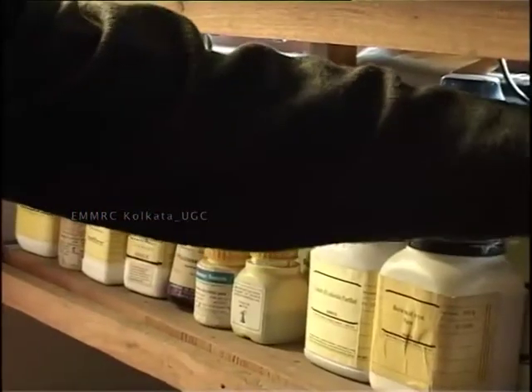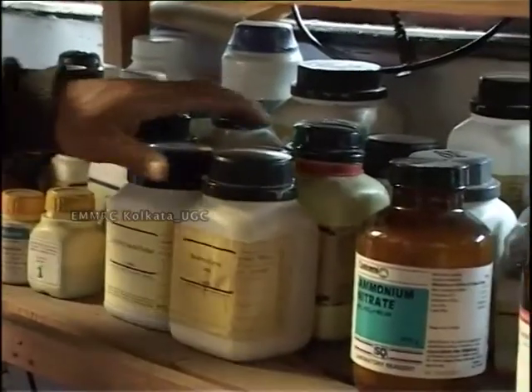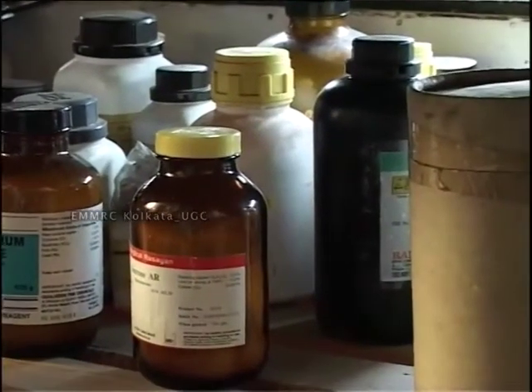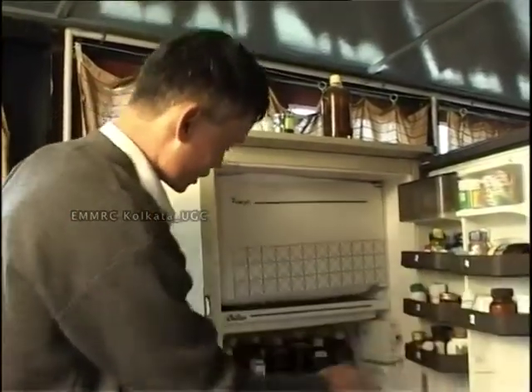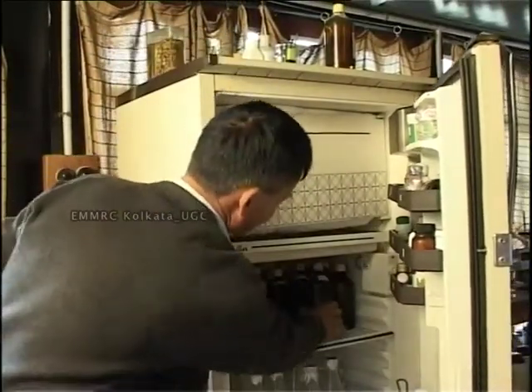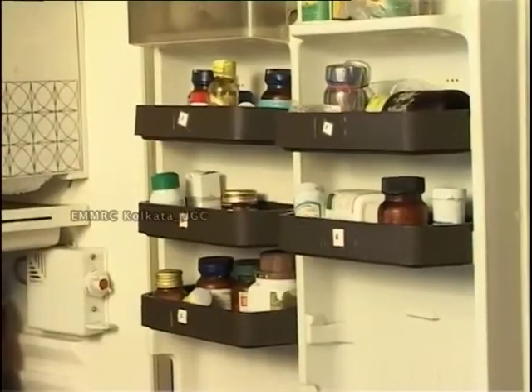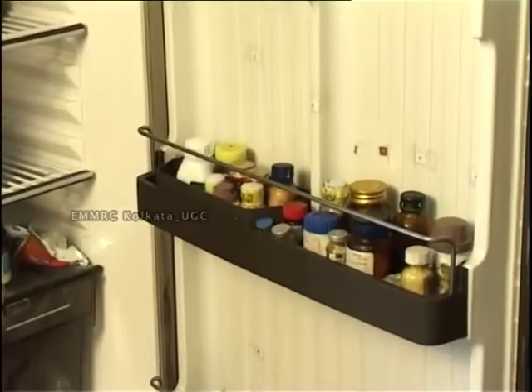These are the chemicals for preparing the media. It is always advisable to prepare the chemicals and keep them as stock solution in a refrigerator. Of course, growth hormones and vitamins should also be stored. The stock solution must be properly labeled. When the stock solution is taken out from the fridge, it should be brought to room temperature.